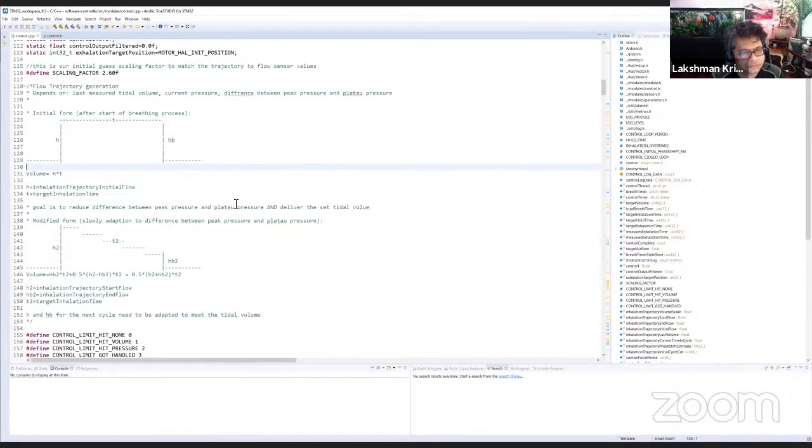Usually what you would see on the lung simulator is, if you connect everything and set it to 500 milliliters and 25 breaths, the system would start with, I don't know, 300 milliliters and 20 breaths, and then work its way up. All the initial values are relatively conservative so that we don't go above the target values, but then it adapts to everything in the system which is erroneous and takes the sensors as reference, so that in the end timing, volume, and plateau versus peak pressure are met. Usually this adaptation takes about 5 to 10 cycles, and afterwards it's stable.